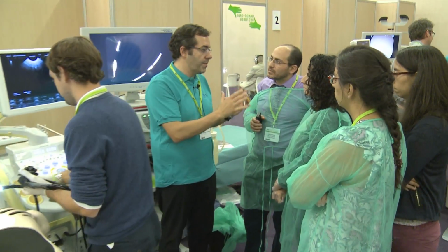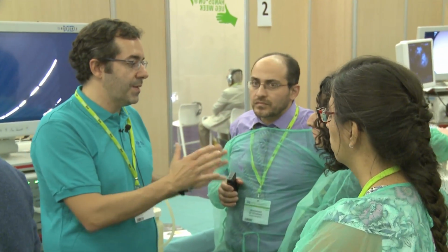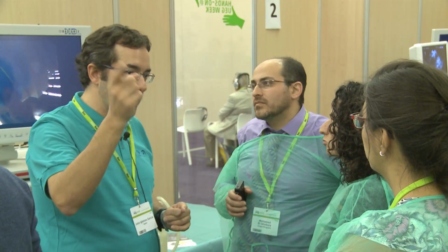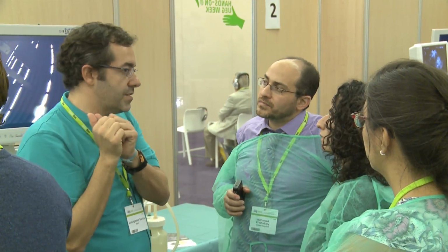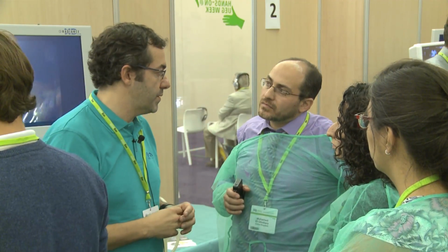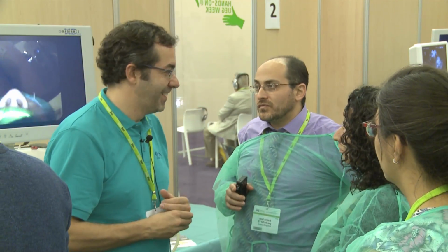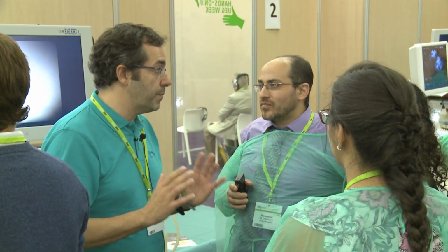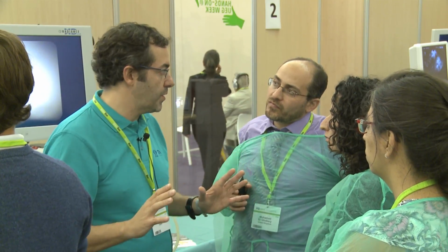The important point is: is this a primary pancreatic lesion? Is this a metastatic pancreatic lesion, or is it a primary pancreatic lesion with metastatic liver lesions from the old colon cancer? Since it was a very complex decision, we needed to target everything, and we did it all by EUS, using more than 1 needle. Yes, we used 3 needles. Well, better my boss not know that I used 3 needles in that case, because he can kill me. But at the end, it's very important for the decision for the patient. It is completely different if it's a primary pancreatic cancer with pancreatic mets, because the treatment is completely different.